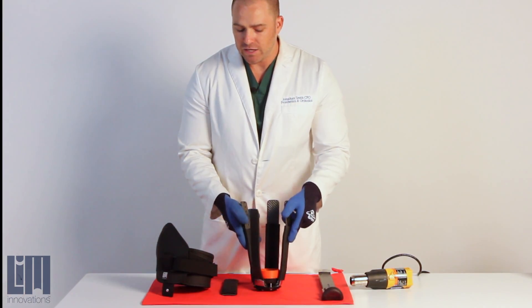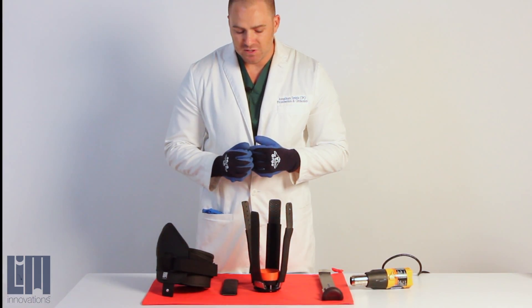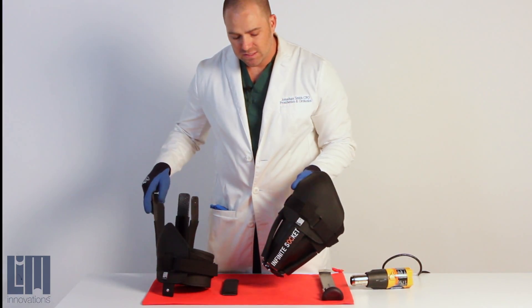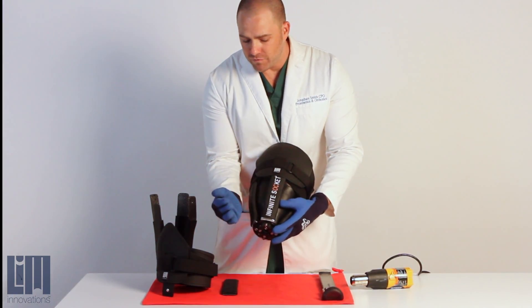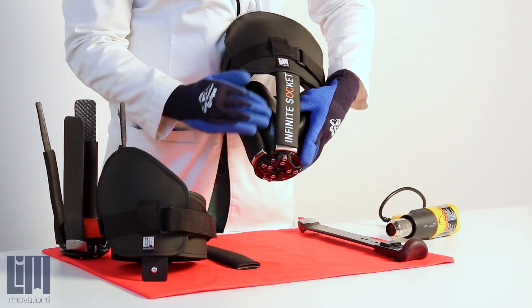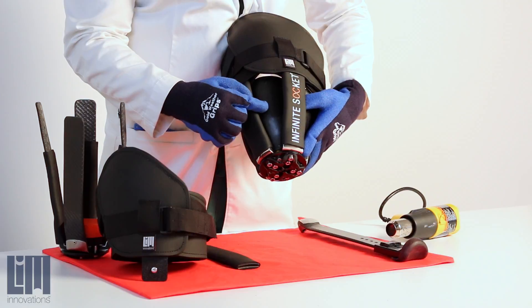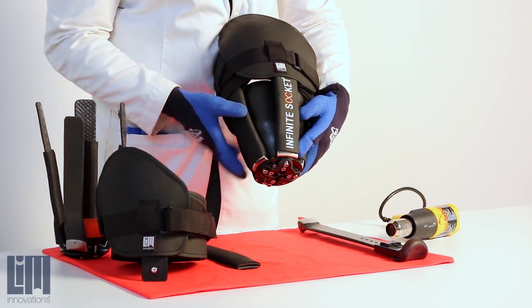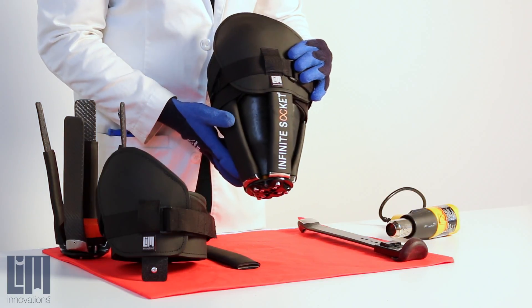This is a lanyard socket that we'll use for demo purposes. But if we're going to be using a seal-in socket, you want to make sure that after you've removed everything out of the way and you're ready to heat up, you want to have some sort of barrier protecting your cup. If you heat up your strut and forget to protect your cup, your cup can be damaged.